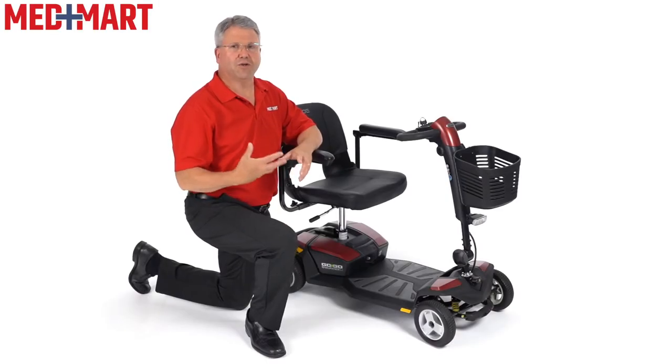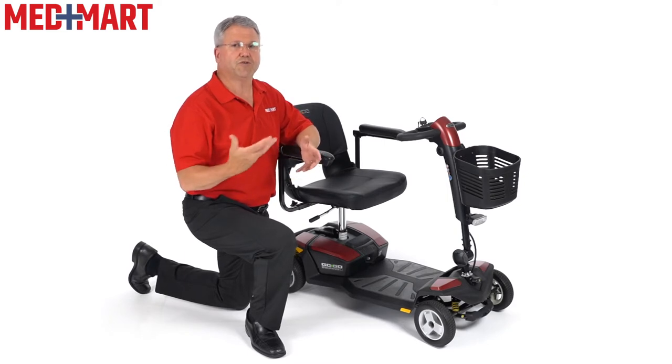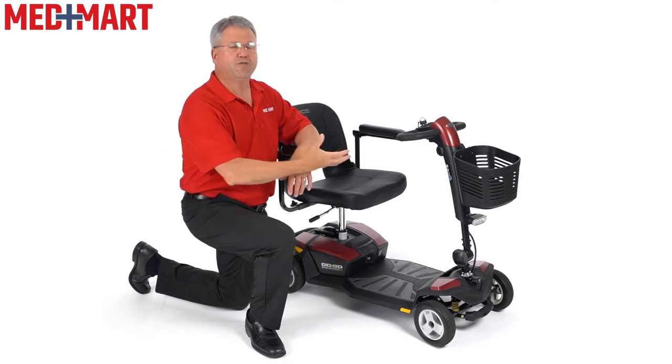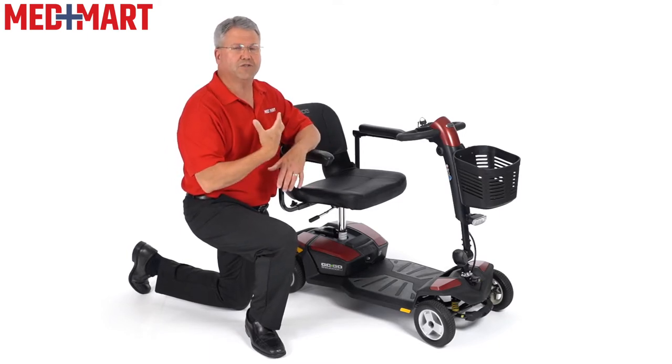Hi, it's Jeff, product expert with MedMart. This is the GoGo Endurance Li. We're going to go over a few of the setups and how to customize a scooter for you. We already have a video on our site that does a great job of just looking at the overall scooter, but I'm going to show you a few tricks of actually customizing the scooter for yourself.